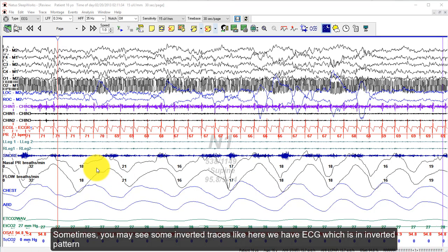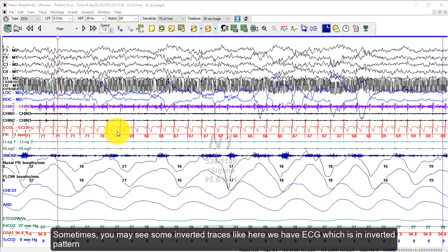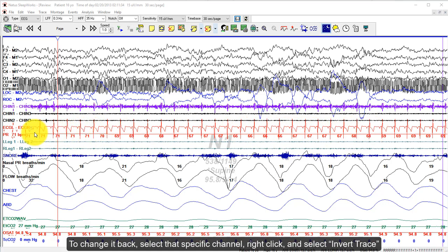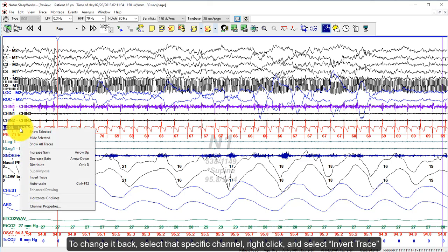Sometimes you may see some inverted traces — for example, here we have an ECG which shows an inverted pattern. To change it back, select the channel, right-click, and select Invert Trace.